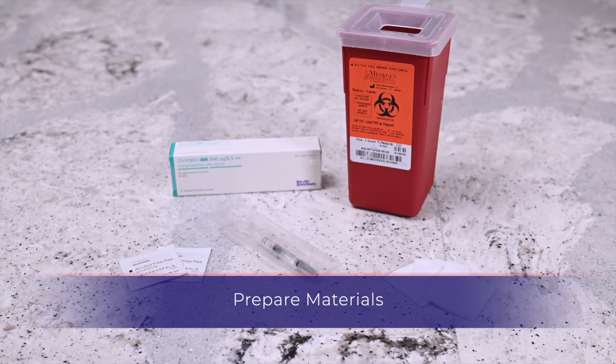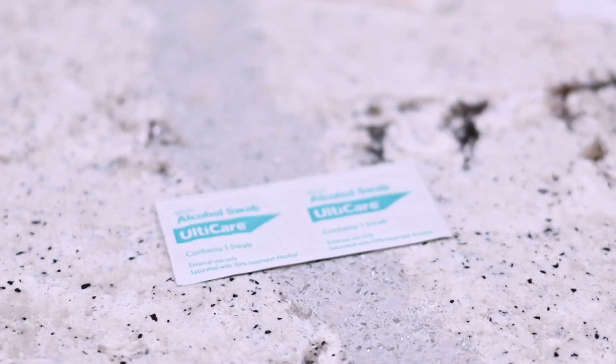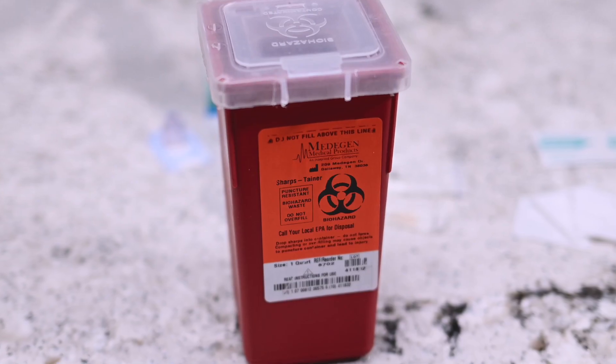You will need the following items: a sterile pre-filled Avadryl syringe, gauze, alcohol prep wipe, and a sharps container.